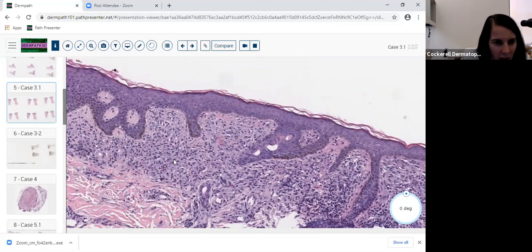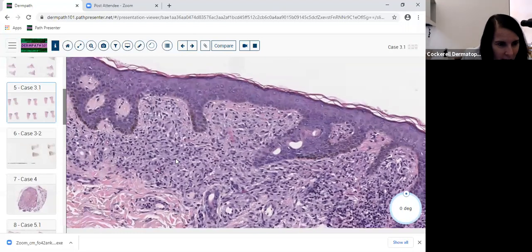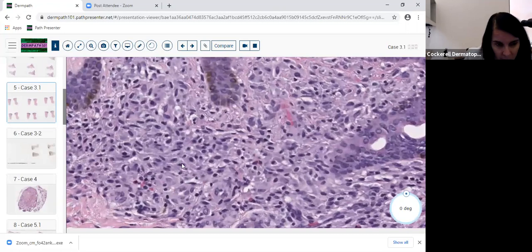So I want to do a stain on this. I'm not absolutely certain. The clinical isn't giving me any clues. They're saying these are brown macular papular lesions, and there are multiple on the trunk and extremity. I think I would like to do a tryptase, because I want to rule out mast cells here, or actually prove that they're mast cells. I'm suspecting they're mast cells because they're mononuclear.